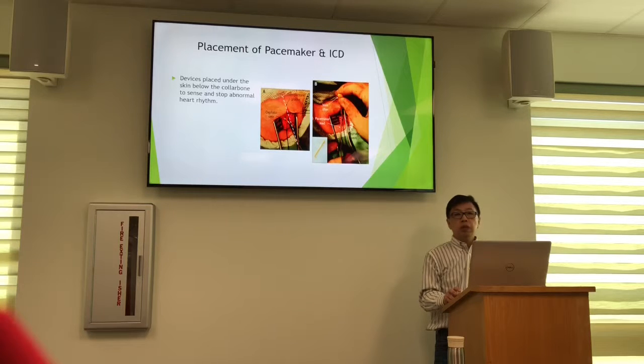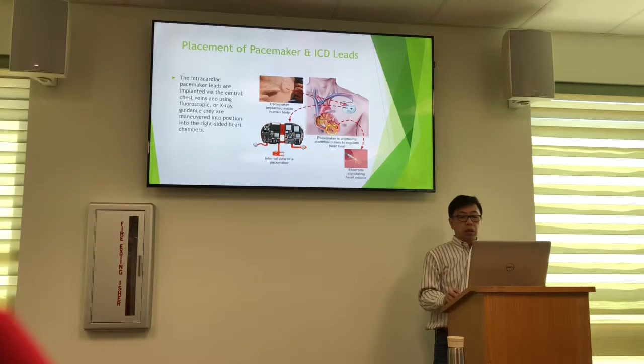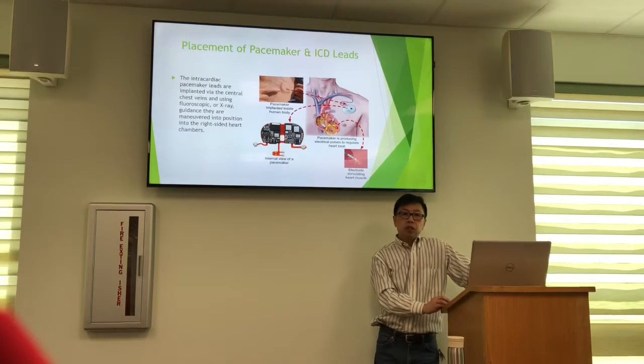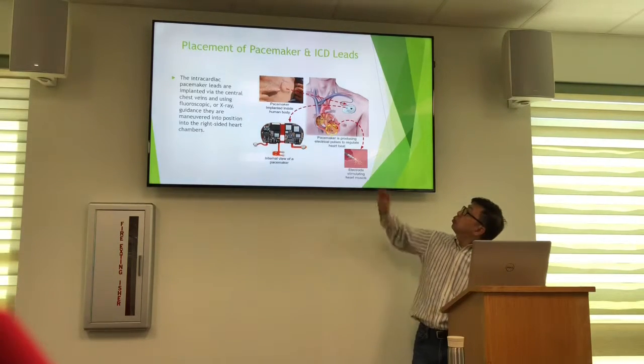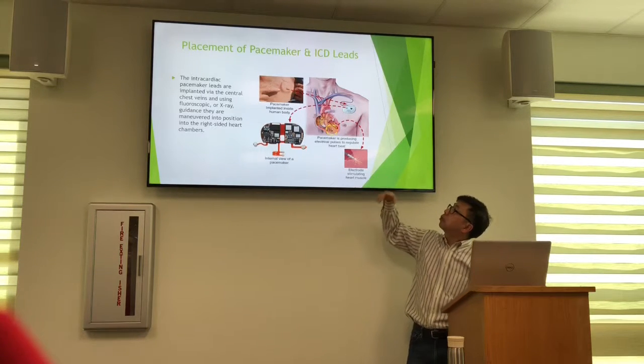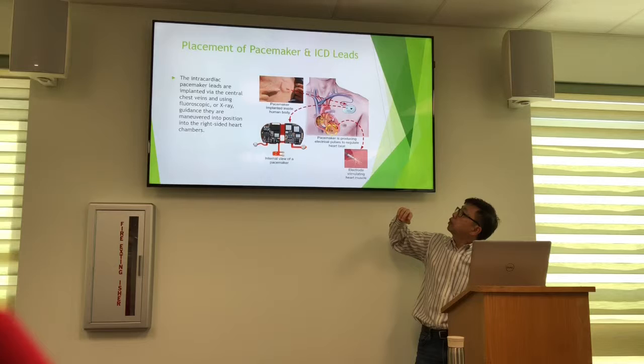Once the vein is exposed, the lead that connects the heart to the device will be inserted through the vein into the heart. During the procedure, the placement of the lead will be guided under X-ray. The blue wire that you see in this picture is actually white, but just for presentation purposes, we're using blue so you can see it.